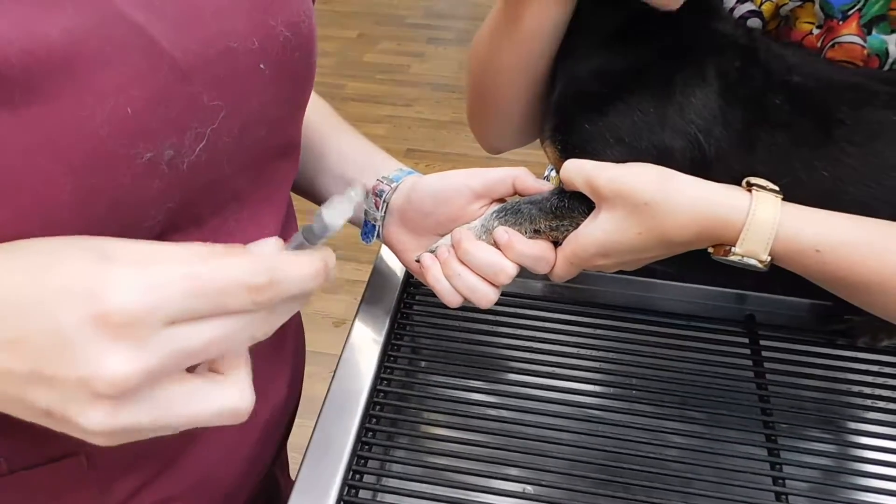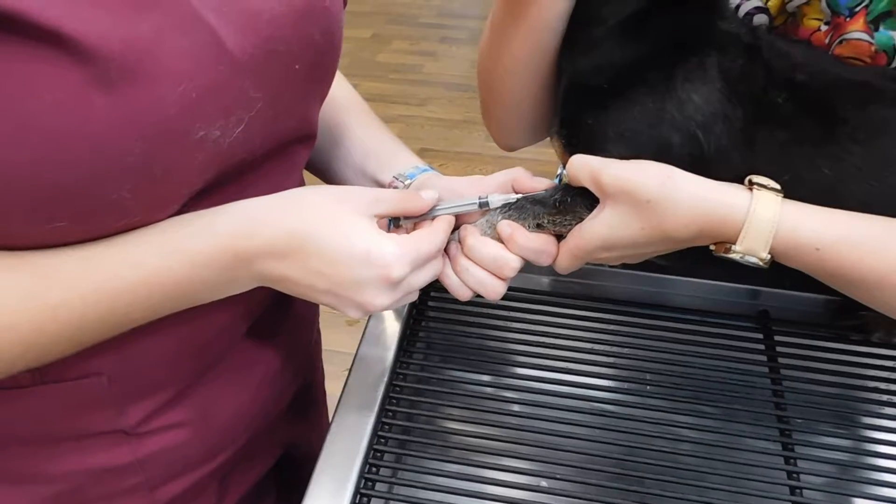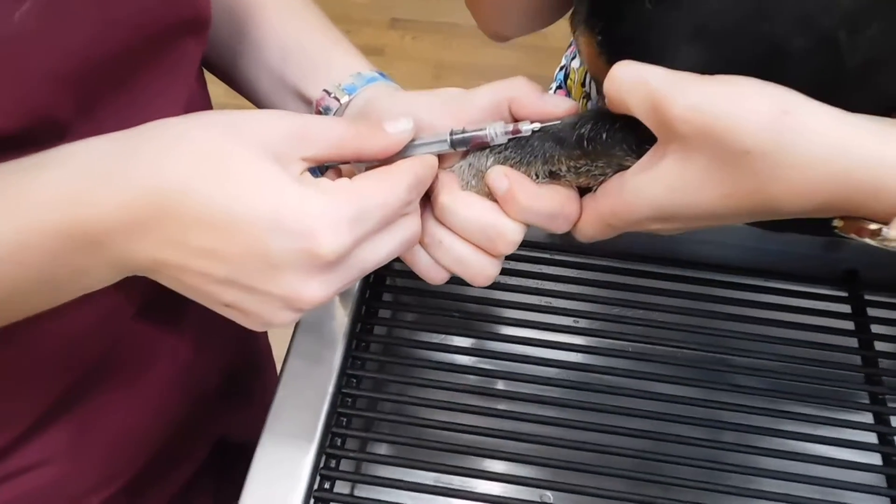With the bevel up, I'm going to insert my needle. I've got my flash, so I'm just going to pull back on my syringe.